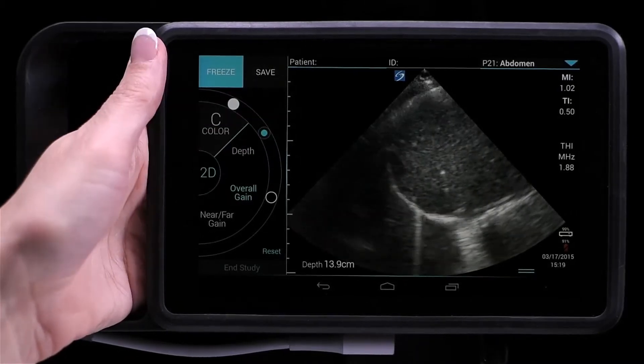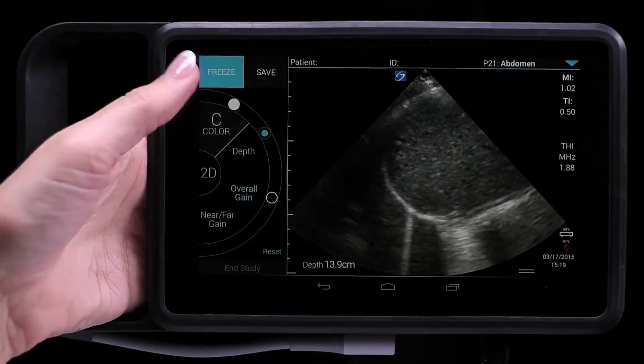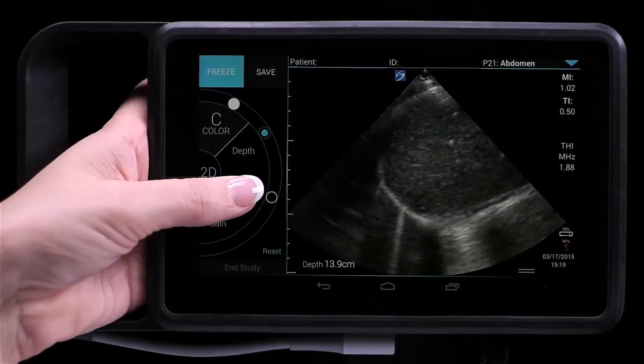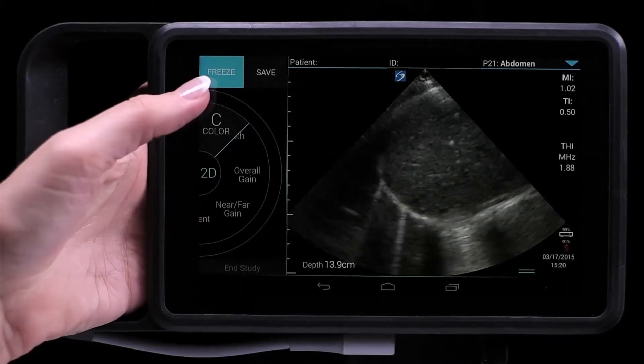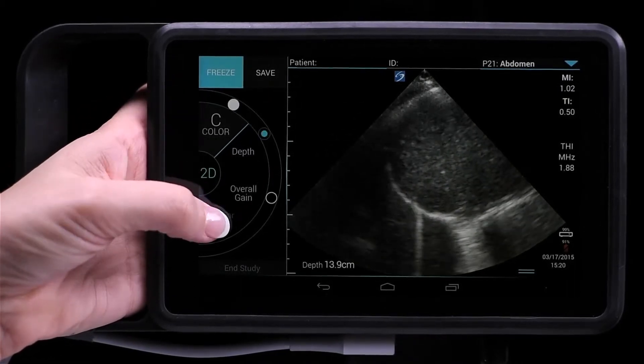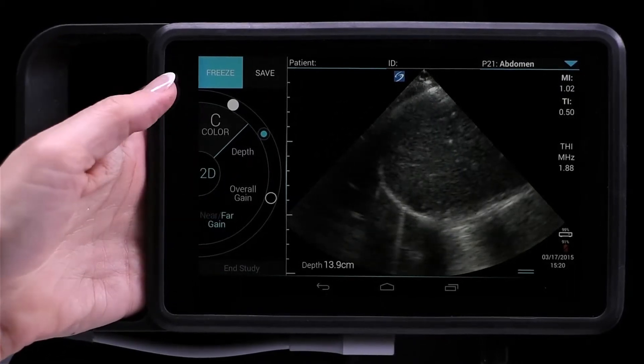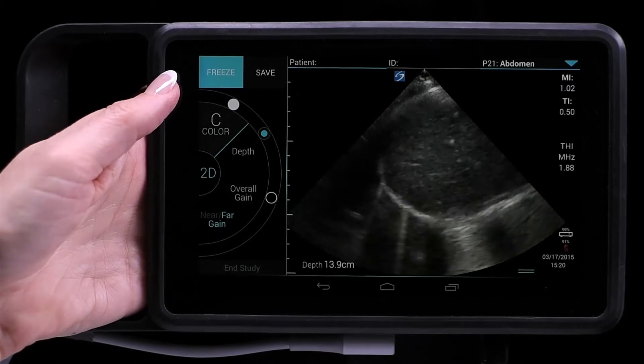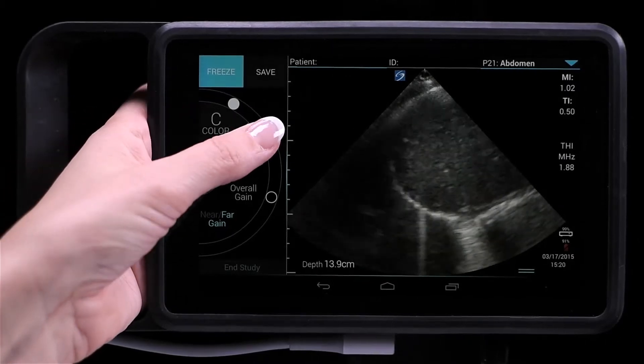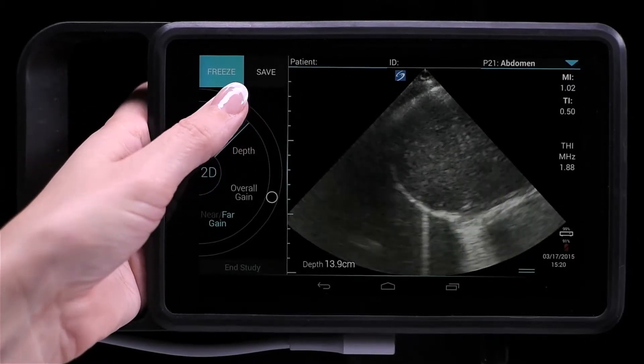Your near and far gain can be adjusted by toggling between near and far. To set the gain, move the blue dot up and down the slider.